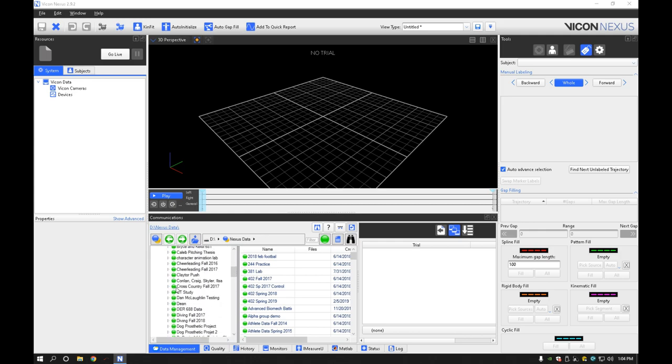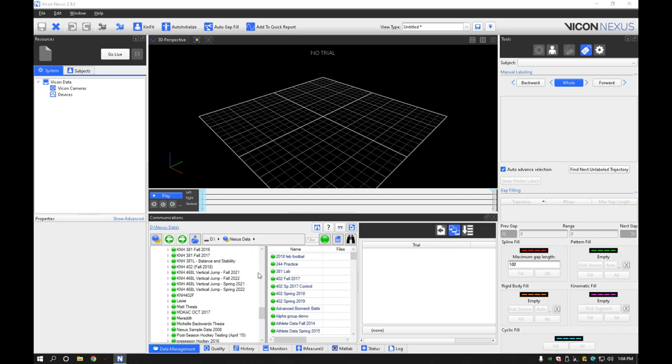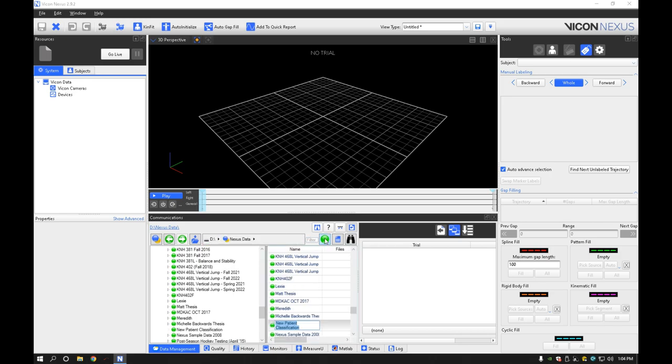So let's go ahead and take a look at some of these. We got KNH 468 lab vertical jump stuff starting from fall and spring and so on. So we'll just come up to this green icon and create a new what's called patient classification. I'm not a big fan of their naming scheme here, but it works and we'll show you how to get through it.